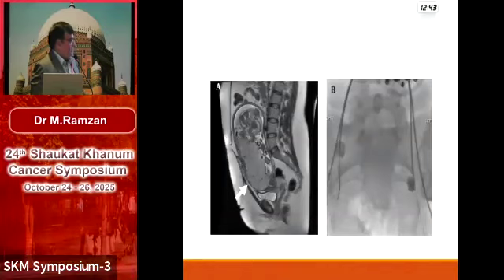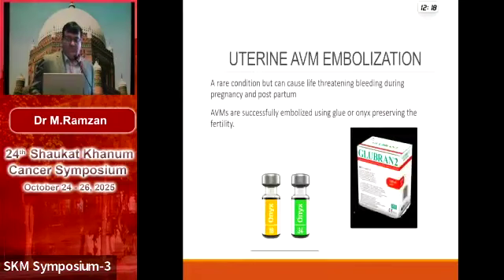The cycle is 13 into 2, 13 minutes inflation and 2 minutes deflation. There is a new technique, the distal aortic balloon, that can be inflated in the infrarenal aorta, and you can do a similar thing, and that's very easy. You can even do it without fluoroscopy, because there are certain markers on it. So that has changed the whole thing.